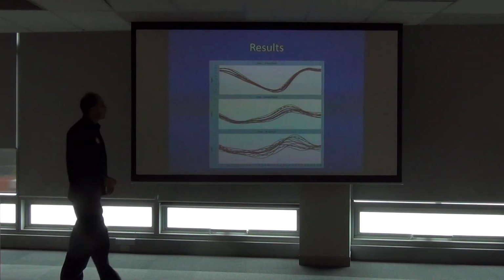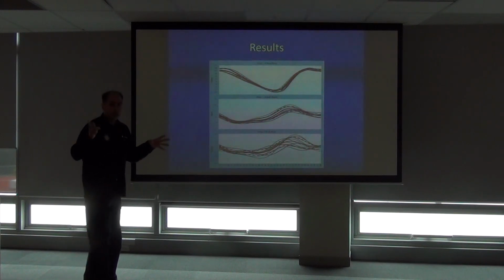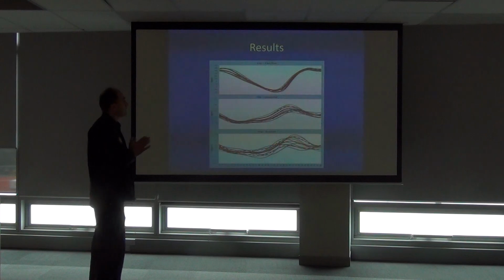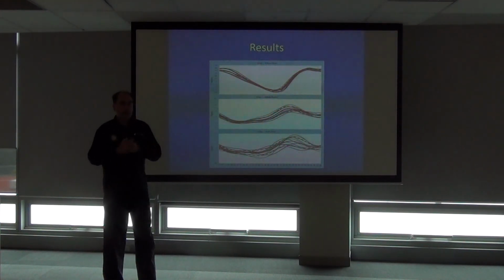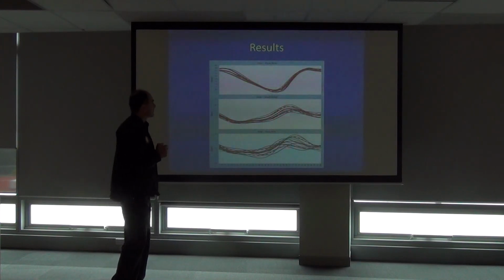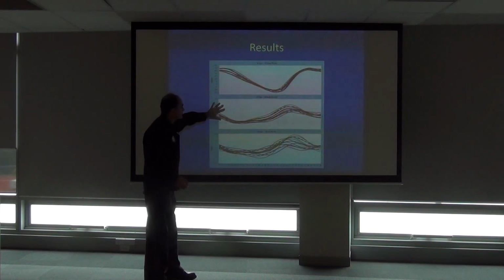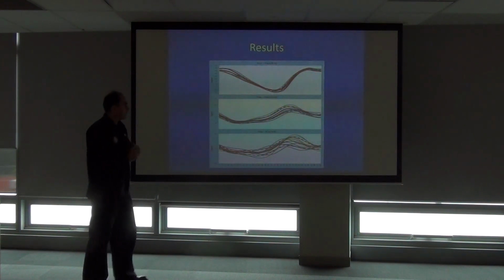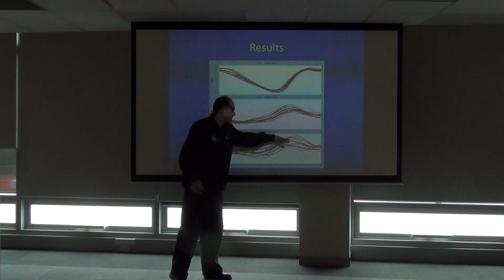Okay, what we're going to have a quick look at now was very relevant to what Kelly was talking about before, about stance and swing. This is the overall results of 10 participants, okay? This is just the whole 10, what it looks like. Knee, hip flexion extension, hip adduction, hip internal external rotation, whole 10. And this is the between participant variability here.